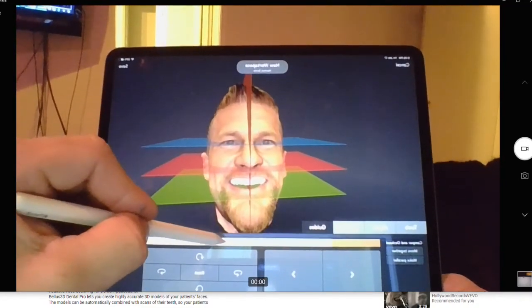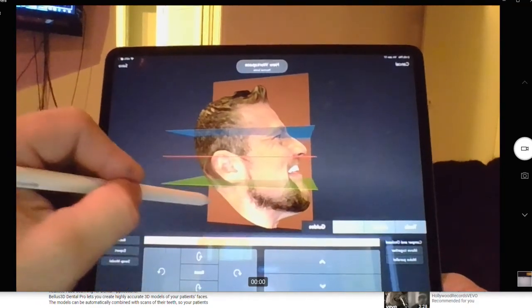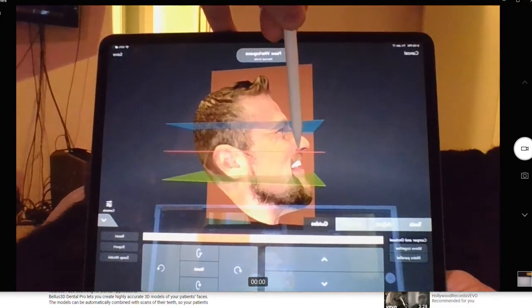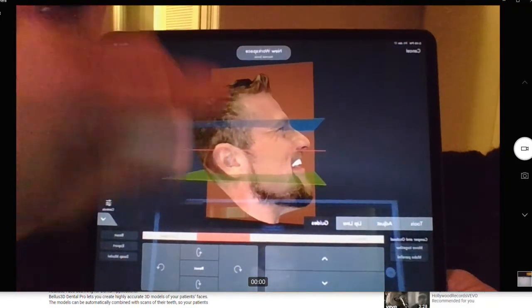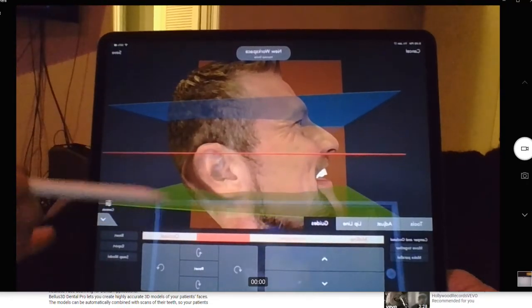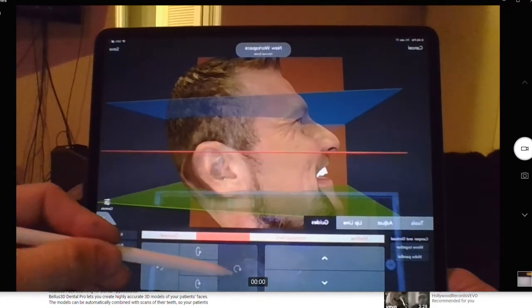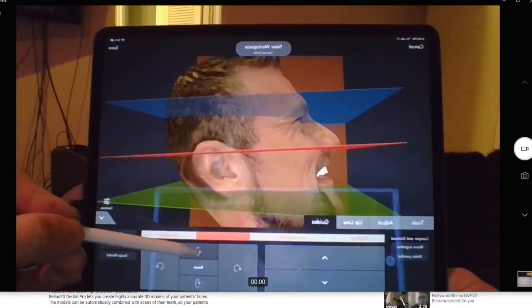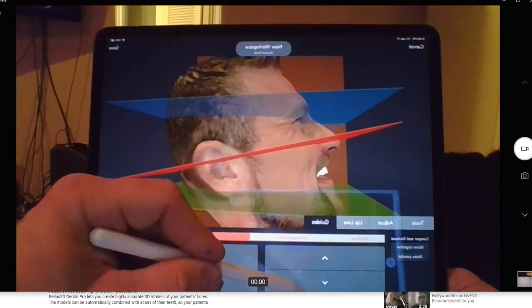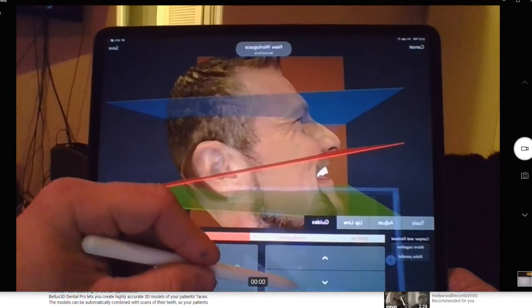Level. Next one is Camper. That's our ala tragus one. So that one's not very good, right? So that's the ala, and that middle of that little dot right there, that little bump on my ear, the middle of that is my tragus. So we need to, oops, which one's going to do that? Yeah, I need to do that a lot, and then the bottom of the nose.